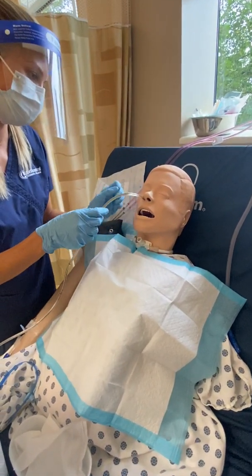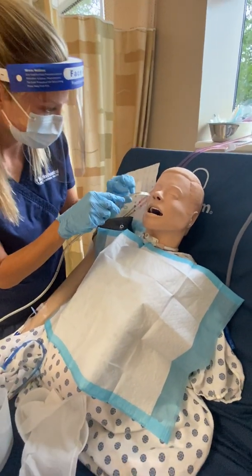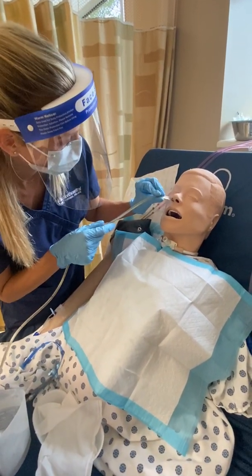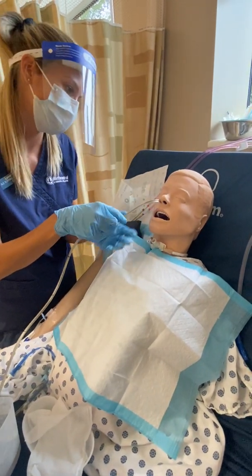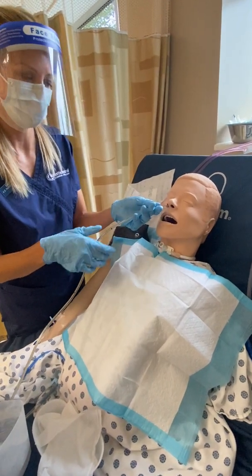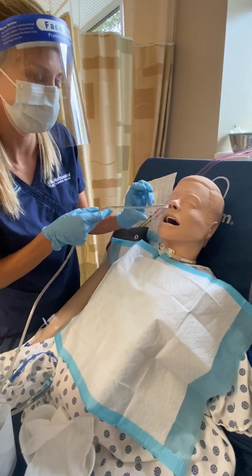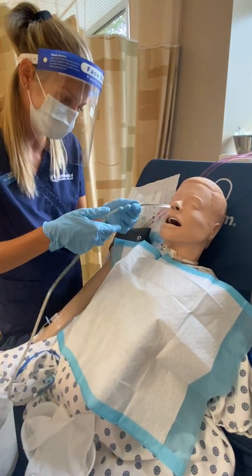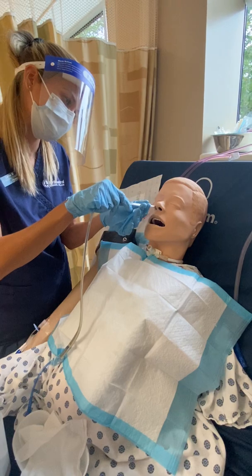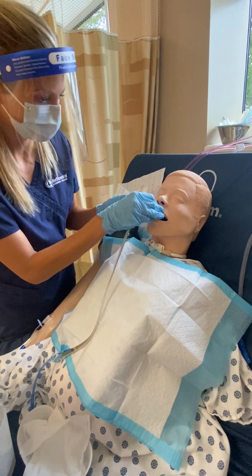All right, so now that I have it in a little bit, I'm just going to have you sit up forward for me a little bit while we move this down, and then if you're able to swallow, go nice and slow here. Are you doing okay, Jane? And she says she's doing okay. If the patient were gagging, I would want to stop and give her a second, especially since she can't really swallow anything. So just move all the way gently, and stop if I felt any resistance. Okay, all right, there you go.